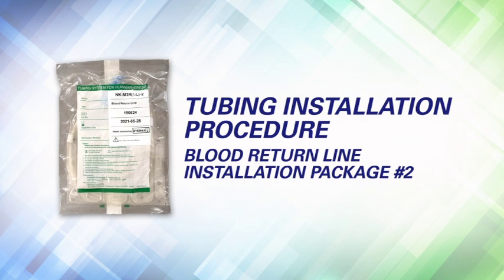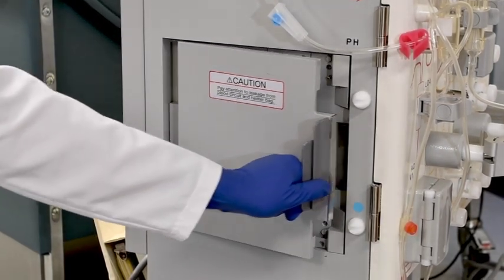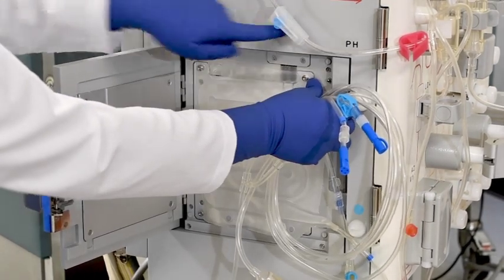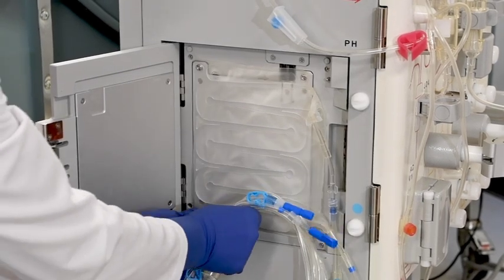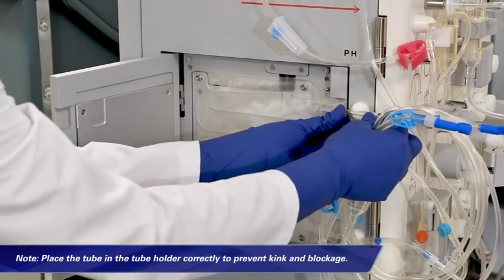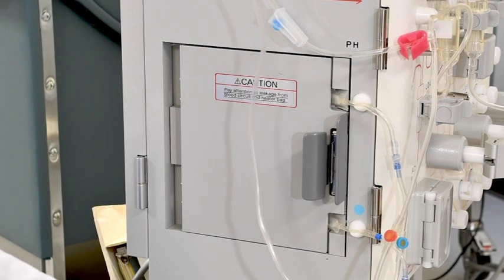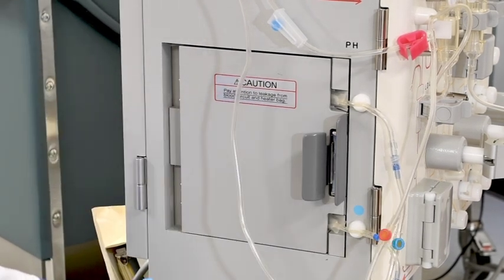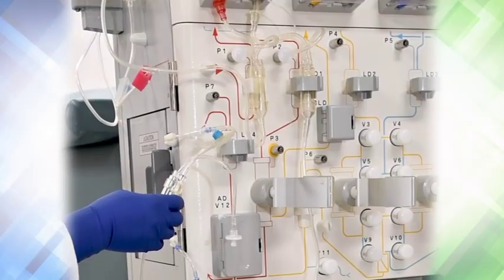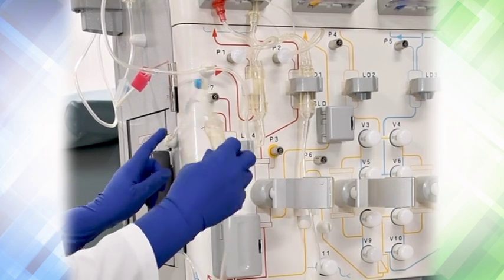Tubing installation procedure — blood return line, package number 2. Attach the blood warmer bag to the plate heater; the arrow on top of the bag should be pointing to the right. The blue-banded inlet part of the tubing on the lower right side of the bag should match the position of the blue dot on the heater plate. Place the tube in the tube holders correctly to prevent kinks and blockage. Squeeze the door handle to close the plate heater door securely, being careful not to pinch or bend the bag and tubes. Pull gently to confirm the door is properly closed — always squeeze the door handle when opening and closing. Attach the blood return chamber from the output side of the blood warmer bag at the top of the heater to LD4.